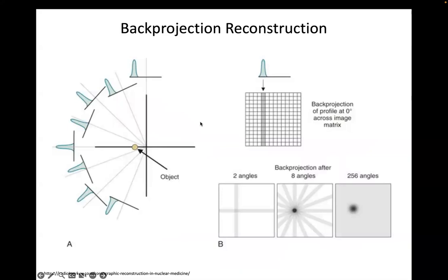And that reconstruction is done pretty well exactly the same, using the same principles that computed tomography uses. And if you look at just naive back projection, if I have a dot of activity in my scanner, when I look along my detector, it maps to some blob, like a Gaussian blob with a full width at half max of my spatial resolution. If I take multiple angles of where that dot shows up on my detector, I can propose an extraordinarily simple way of reconstructing where that dot is.